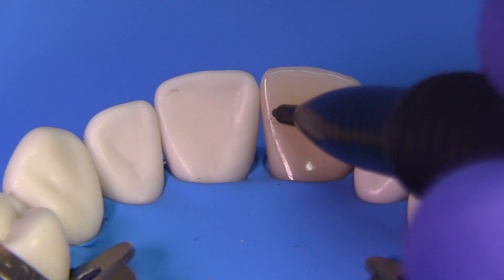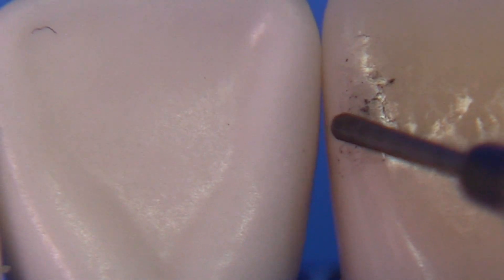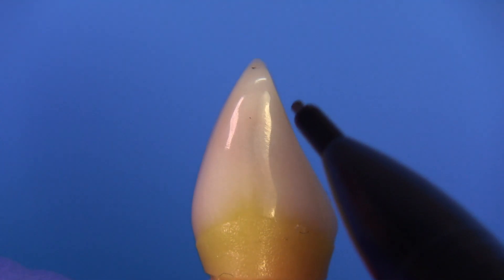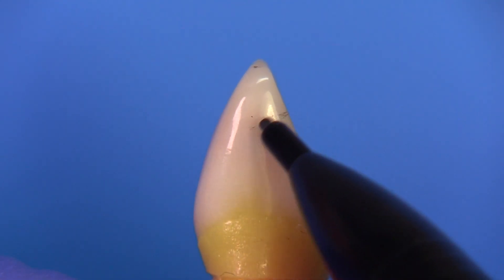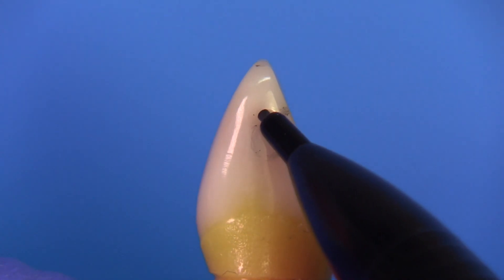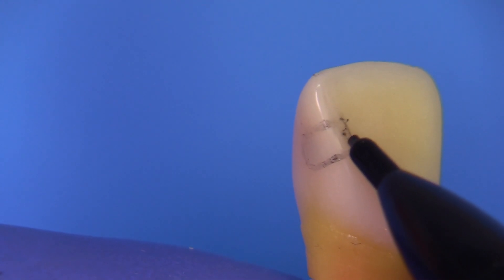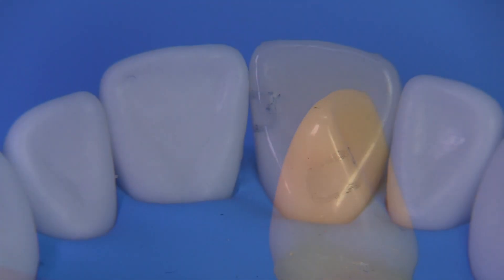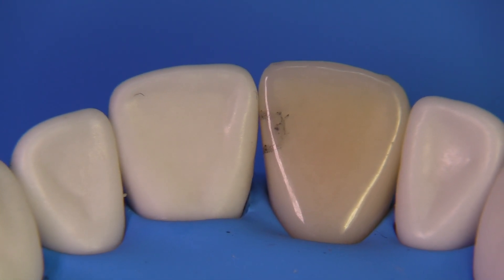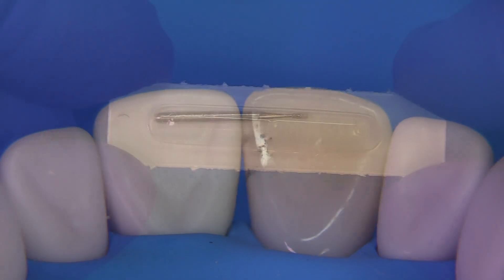Once we place the rubber dam for the 8X exam, we're going to outline the preparation. I like to use a mechanical pencil to do this, looking closely at the area — it's got a really small contact point so we want to be mindful of that. I went ahead after marking it and removed the tooth just to show you the proximal preparation design. It's going to come in at a 90-degree angle and curve on the facial to follow the general curve of the facial wall. You are allowed to use pens or pencils in the examination, and in patients too — when you have good isolation it can be helpful. Keep an eye on this outline — this is the ideal outline.